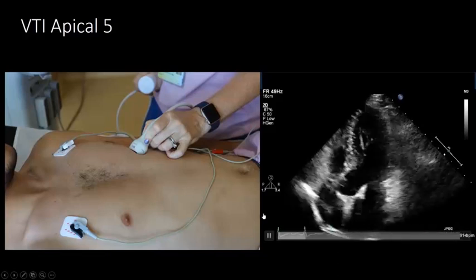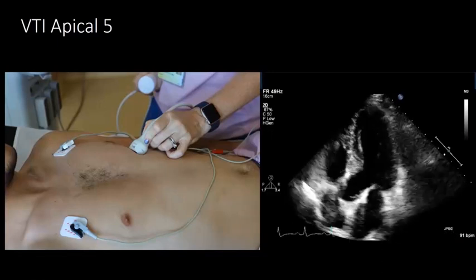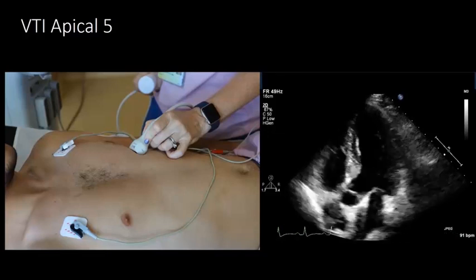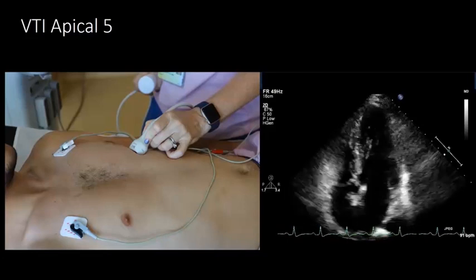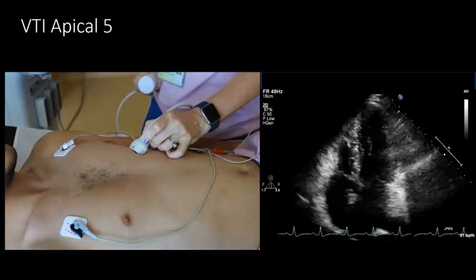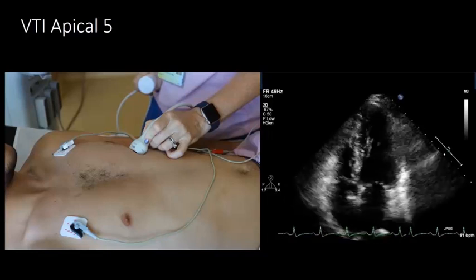The next important measurement is the left ventricular velocity time integral, or VTI, obtained in the apical five-chamber view. The best way to get this view is either at the point of maximal impulse (PMI), or in most critically ill patients, start very lateral in the fourth or fifth intercostal space with the transducer pointer toward the patient's left shoulder. In intubated ICU patients, the heart is often more medial and inferior than in an outpatient echo lab, so you may need to scan right and left to find something beating — it can be almost anywhere on the left side of the chest.